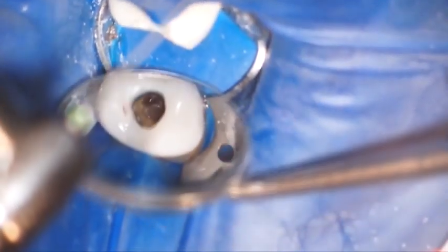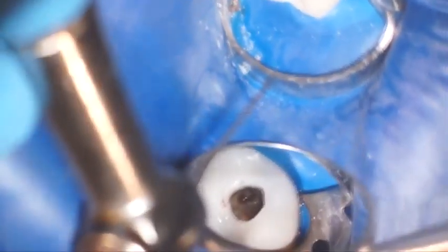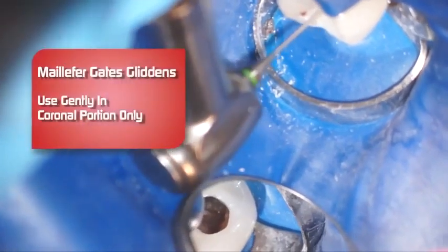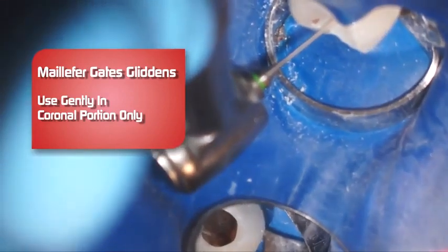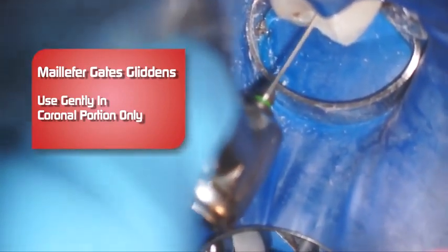Now we're going to introduce the Gates Glidden burr, but as opposed to the previous case, this one we're going to stay much more coronal because the canals are tighter and much more dilacerated. We're going to start out with a number two here in the palatal canal, then the distal buccal and mesial buccal. And no pushing at all.